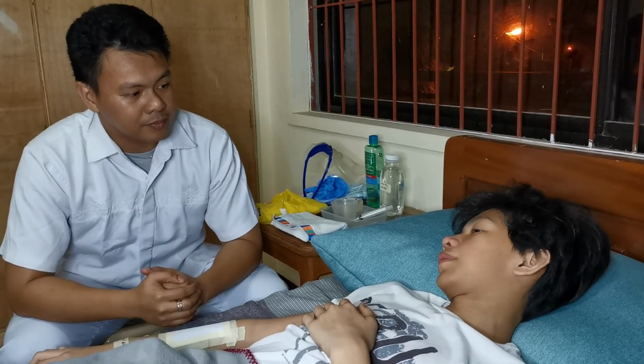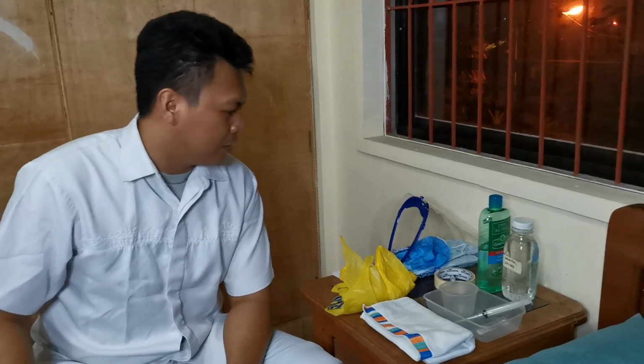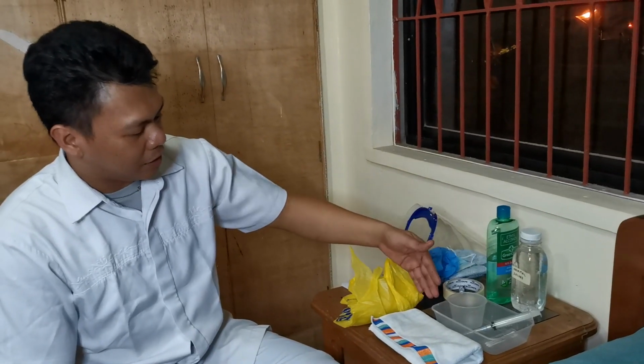Okay? Yeah. Number 4. Gather appropriate supplies. Organization of equipment promotes time management. So we have to gather the equipment necessary. So we have here the normal saline solution. We have our kidney basin.